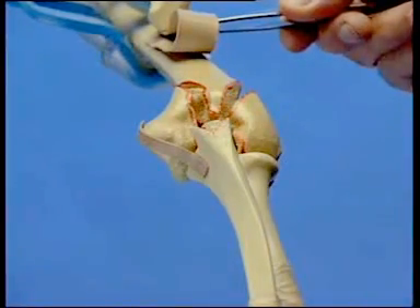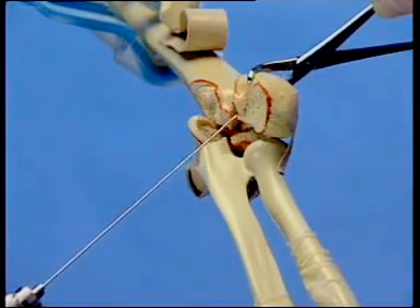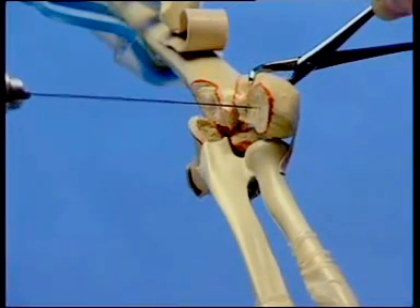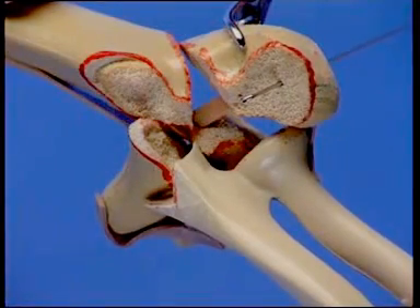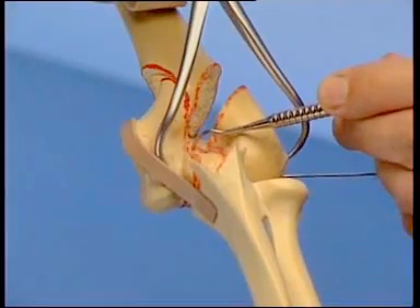In case of an intermediate fragment between the capitellum and trochlea, it is advisable to first drill a K wire into the radial fragment by means of the inside-out technique. The blunt end of the wire is sharpened by an oblique cut. A special 1.25 mm wire with threaded tip is selected because a cannulated 3.5 mm cancellous screw is to be used.